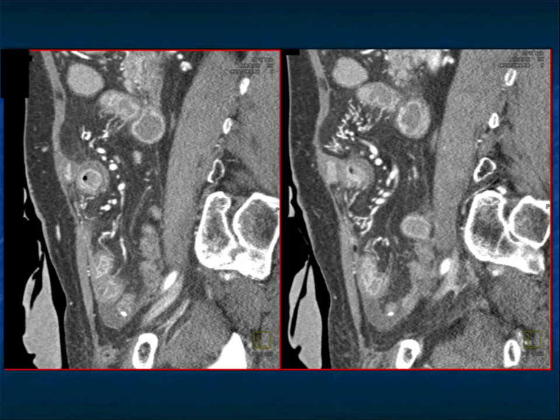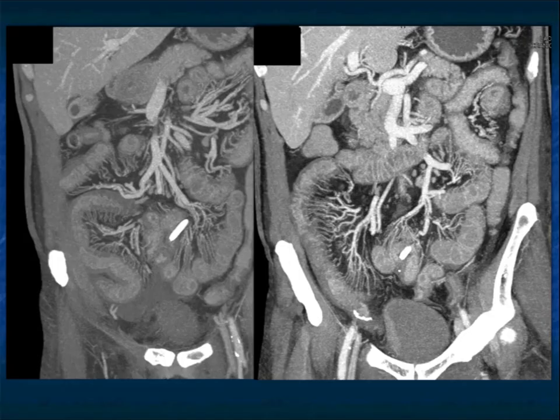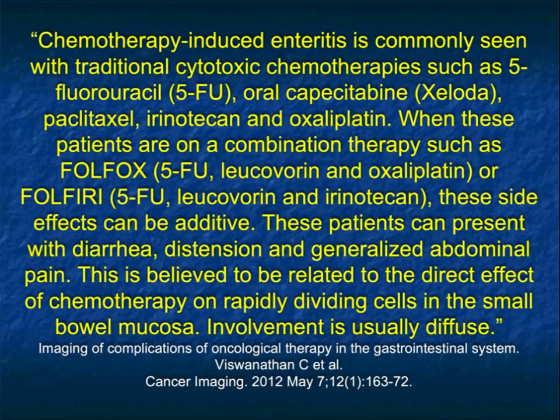Here it is again — the thickening of bowel, the halo sign, mucosal enhancement: a beautiful example of enteritis secondary to the patient's chemotherapy. Chemotherapy-induced enteritis is commonly seen with certain agents like 5-FU and oxaliplatin, which are very common in pancreatic cancer. Patients often will get multiple therapies, and with chemotherapy these effects can be additive, making it more problematic.